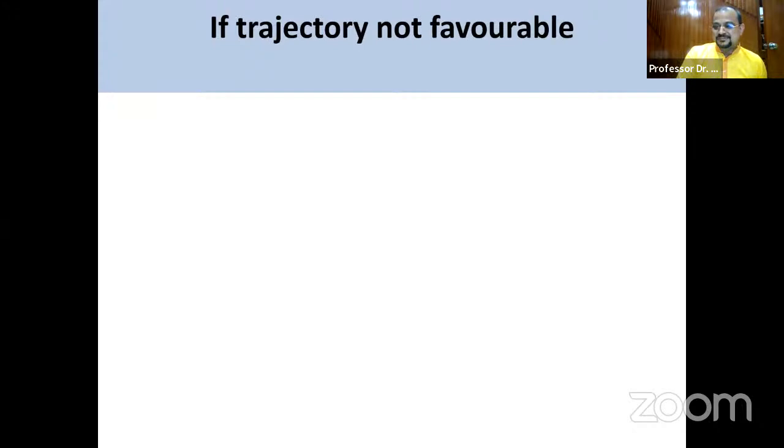I agree with you, posterior is good, but the dynamics in this patient was such that I had to go anterior, and we stuck to that plan. So it's okay to do anterior as long as it's locked in from behind. That would make me comfortable. But with an odontoid screw in a fused segment, the biomechanics are not in your favor. C2-3 is mobile, C1-2 is mobile, and OC2 is mobile. Everything below C4 is fused. How about the usual indication?